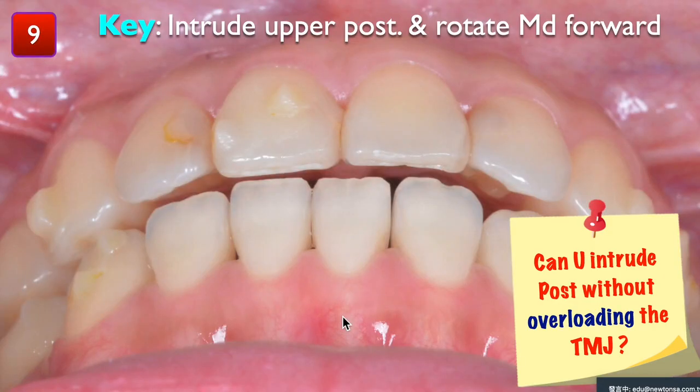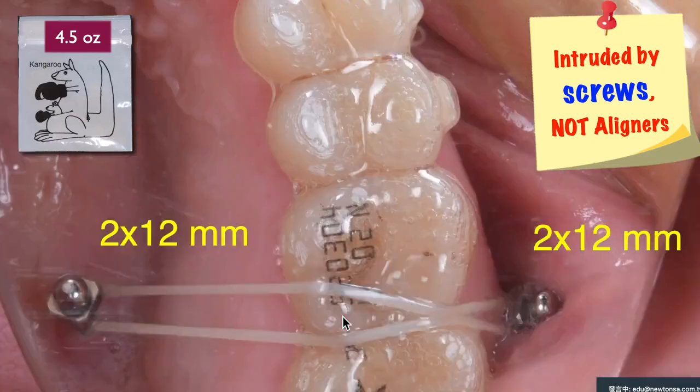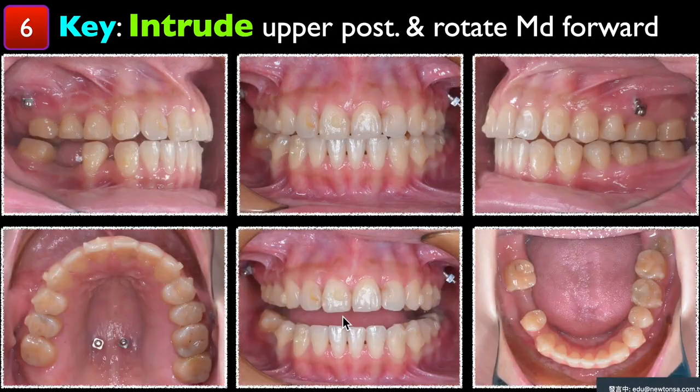9 months in treatment, we were able to intrude the upper posterior and rotate the mandible. Intrude by screw, not by aligner. That's the key. So I put outside and inside screw and wrap around this elastic, and with this mechanic, we are able to intrude the upper posterior and rotate the mandible forward without putting extra pressure on the condylar head.